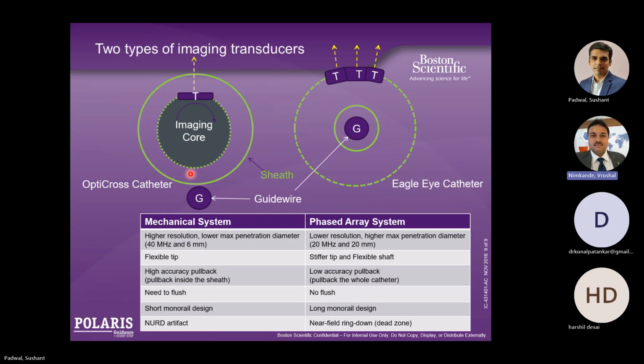You need to just push and pull out the IVUS catheter so that the portion of the proximal tortuous segment or the calcium nodule in that segment, which is pinching the IVUS catheter, will be managed. Like due to the wire bias or due to other reasons, that particular segment may be getting pinched, or maybe because of a poor flush in the catheter, that particular segment of the rotating core is brushing with the sheath at that particular point. So if flush is adequate, everything is perfect, then NURD can also be resolved. It is not like that NURD cannot be resolved.